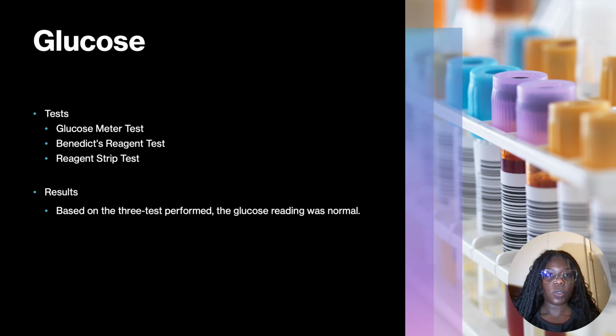So now onto the chemistry of these different tests and also the value that it brings. Each of these tests uses an enzymatic reaction which involves glucose that results in a reaction to measure and correlate the glucose concentration.